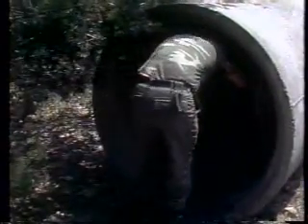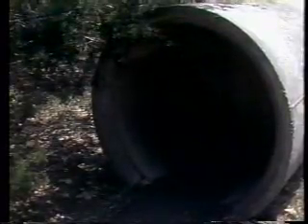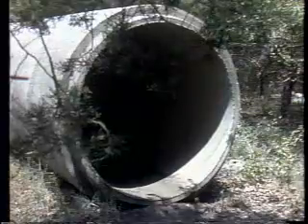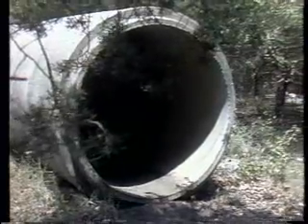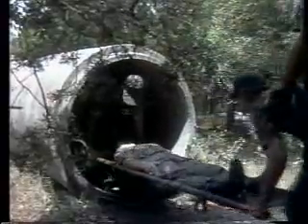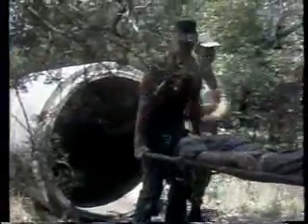Notice that the number 1 and the number 4 team members guide the heads and shoulders of the team through as the other team watches the patient. Again, guiding the team, making sure that they don't drop the patient or possibly injure themselves in this type of obstacle. Once clearing the obstacle, the team would go back into a 4-person carry and continue on.